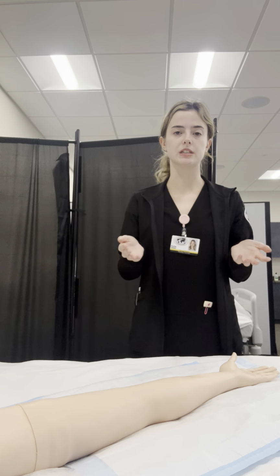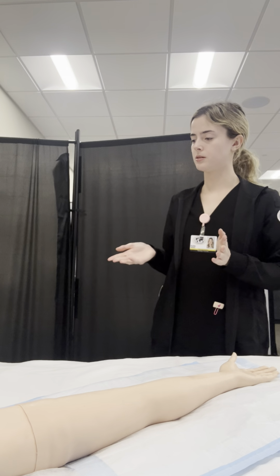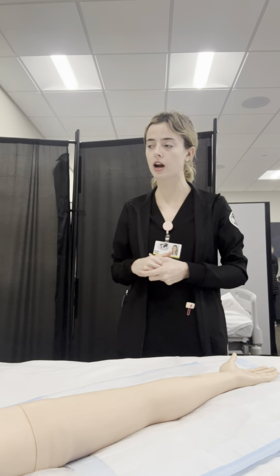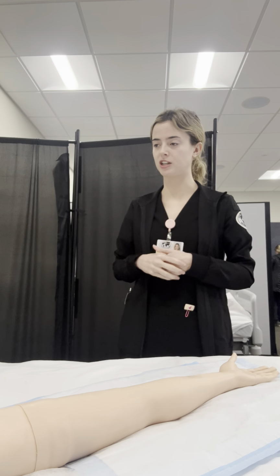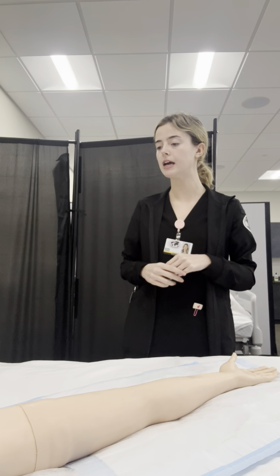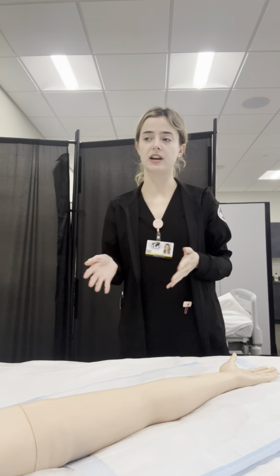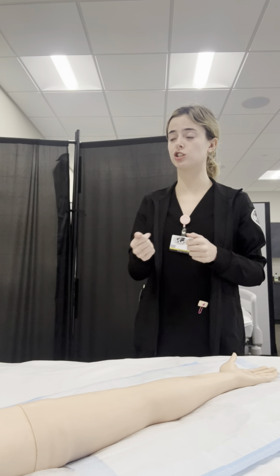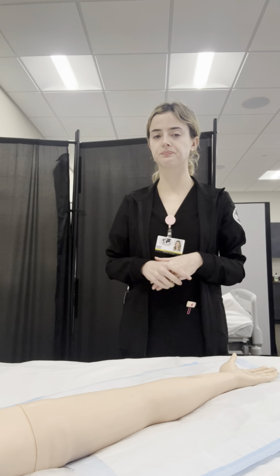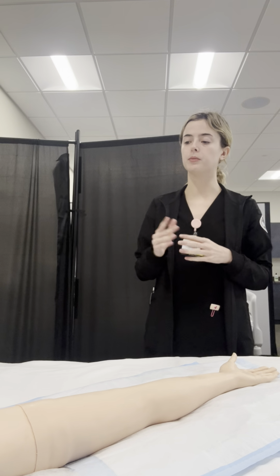Then I would want to explain any signs and symptoms of complications with an IV. So some signs and symptoms that you could experience in regards to any complications with your IV would be any inflammation, like redness or warmth around the insertion site, any swelling, any drainage out of the insertion site. So if you have any of those symptoms during insertion or over the next couple days while you have the IV, just let me or someone else know, okay? So I've explained to my patient some symptoms to look out for with the IV.